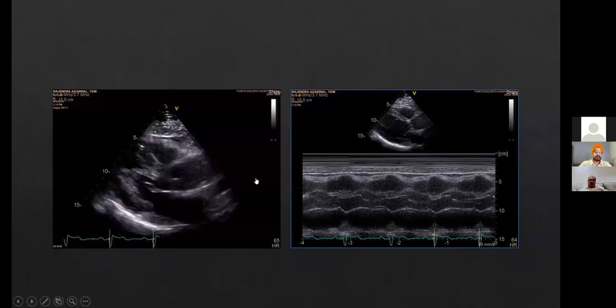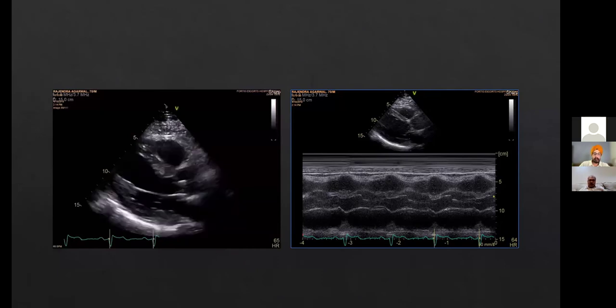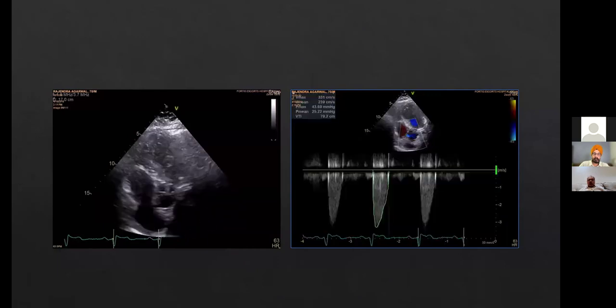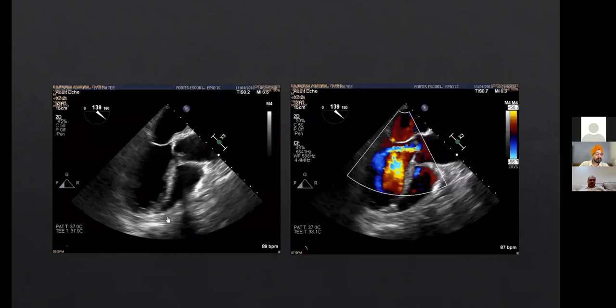And this systolic doming, if you see, is a diagnostic thing for any stenosis. If you see a diastolic doming in mitral valve, it is a mitral stenosis. If you see a systolic doming in aortic valve, it is an aortic stenosis. Now, you do gradients, you find it is a distorted anatomy. This distorted anatomy will keep failing you because you are not going to get the jet into the parallel line. And that's the reason why you have to trust and do something more.